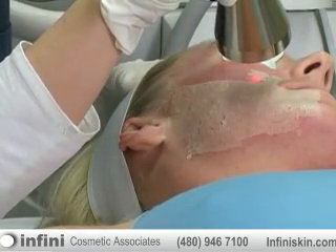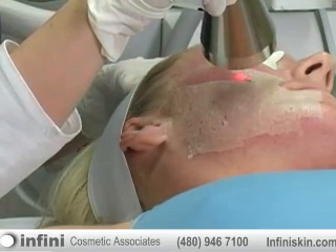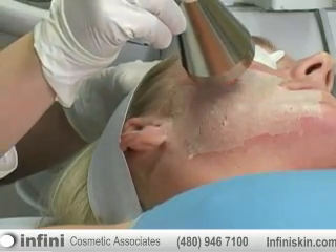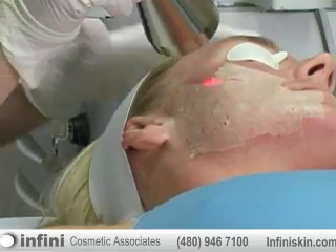There are different definitions of the micro laser peel. Some doctors might do a micro laser peel of 10 micrometers, while other doctors might still consider it a micro laser peel if they go up to 20 micrometers. Clearly, the 20 micrometers is going to give the patient a little bit more downtime than the 10 micrometers.